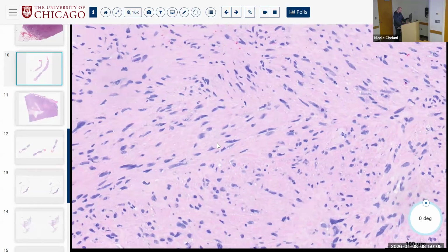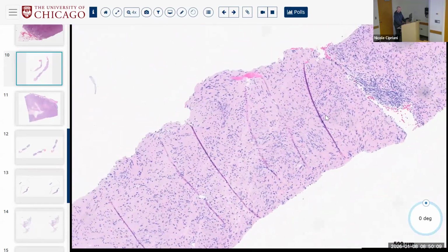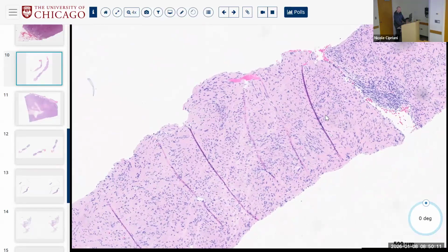So in essence, what are the myoid cells that surround vessels in their mature form? I thought it was like muscle. Yeah, basically smooth muscle-like differentiation. So, did those atypical nuclei bother you for a benign thing?